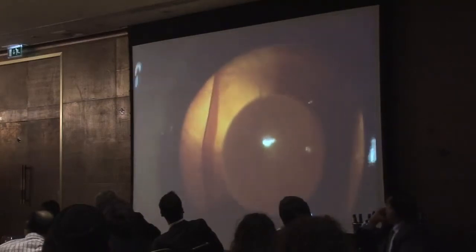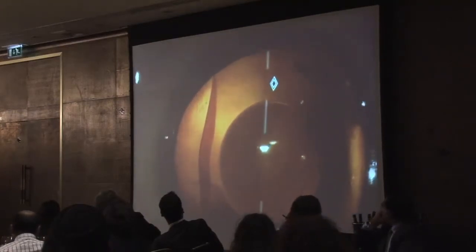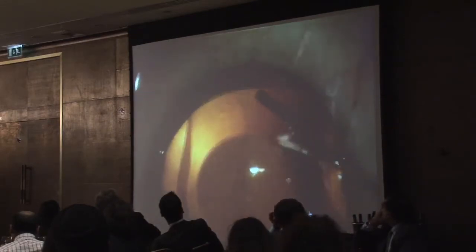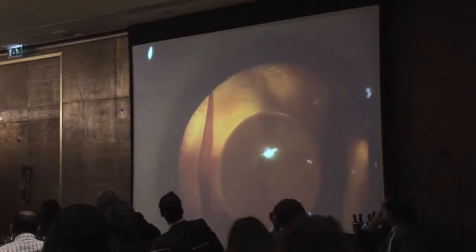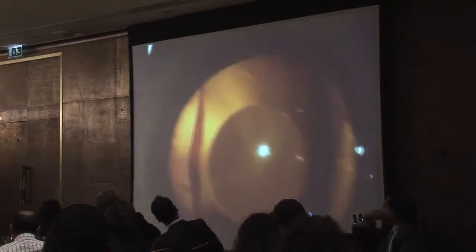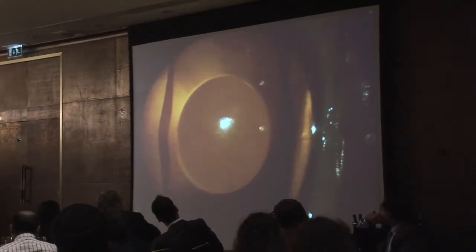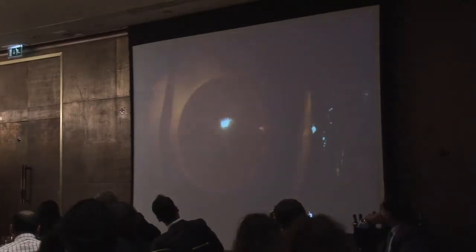At the end of surgery, the diamond-shaped markings on the toric ICL are aligned with the epithelial indentations which indicate the horizontal axis. In this way, the astigmatic correction in the optic part of the lens is aligned with the cylindrical error of the eye. And you can see this is straightforward. He does bilateral surgery, so the patient walks in and 15 minutes later he walks out.